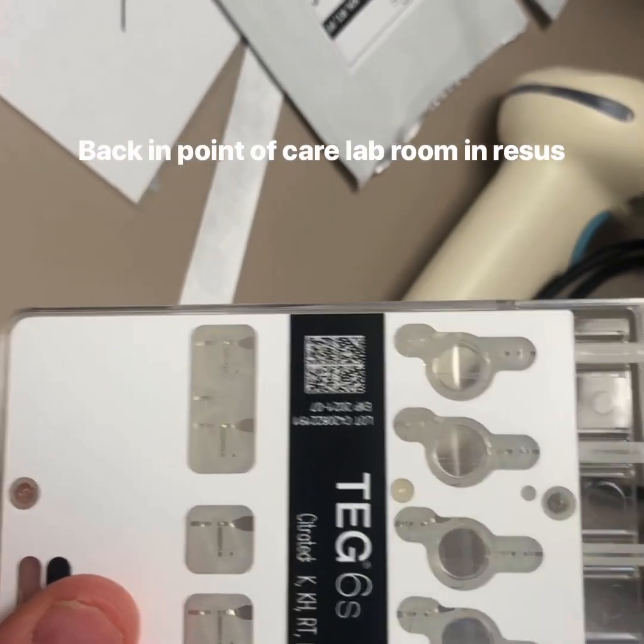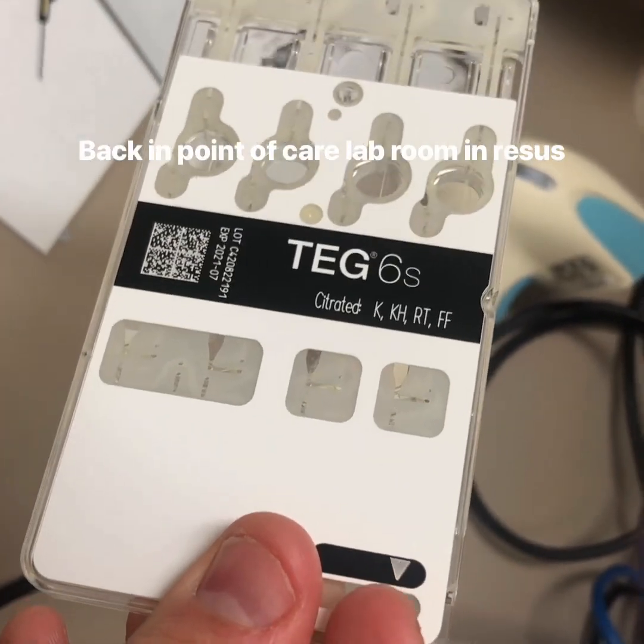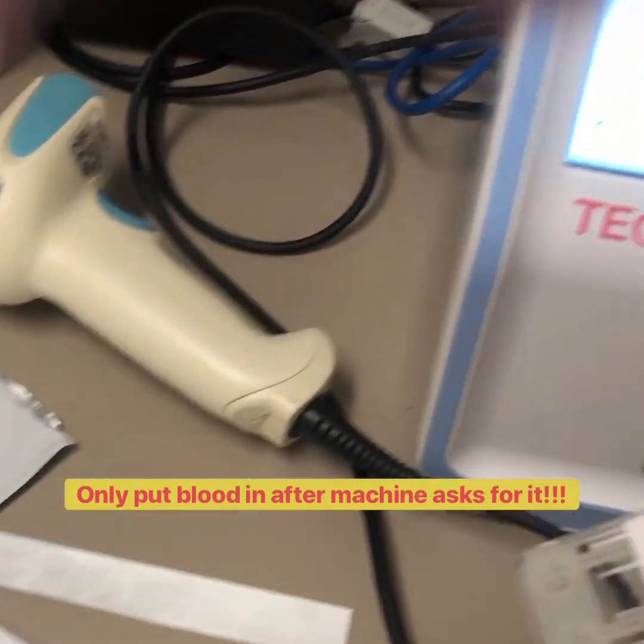We've opened our test — it should look like this. The blood goes in here, filled up to the black line, once it's asked for blood. Then click next.